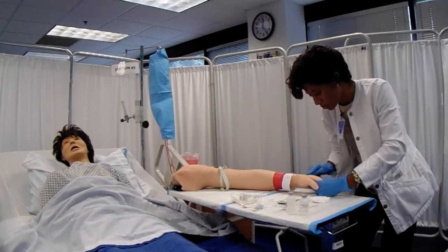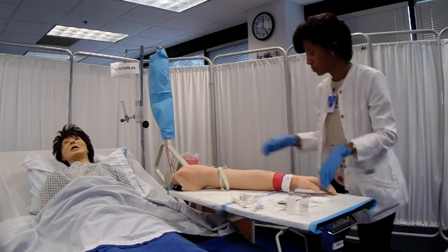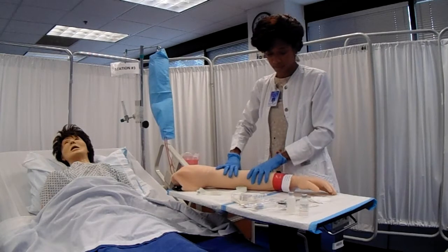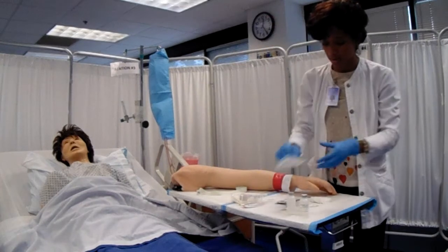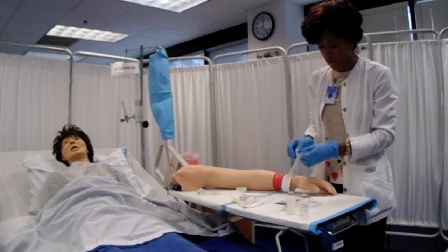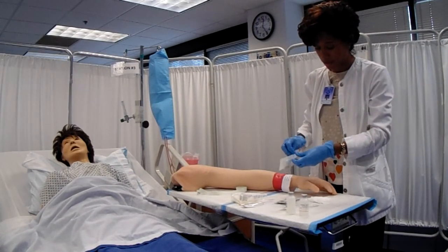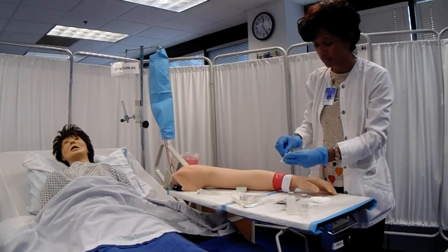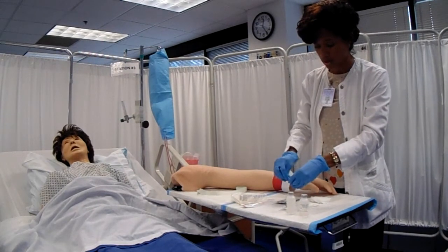Okay, I think I found one. That's good to use. Let me go ahead and loosen the tourniquet. Alright. So now I'm going to go ahead and prepare my flush and my IV catheter. Any questions so far? No? Okay, good.